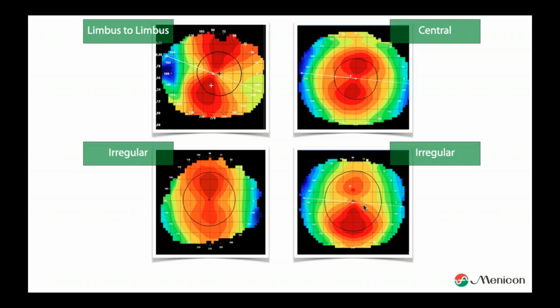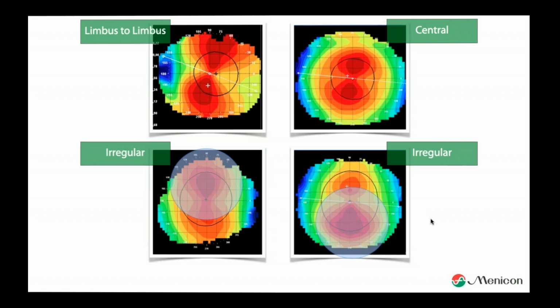The fun thing is, if you fit lenses on these, imagine what is happening. You say, okay, this lens will go superior, this one will go inferior. In theory, this is the case. You would expect that the lens will go inferior, but in practice, it will go superior. Because there is a mismatch with the fit, the upper eyelid will have control of the situation, and you will end up with this situation.